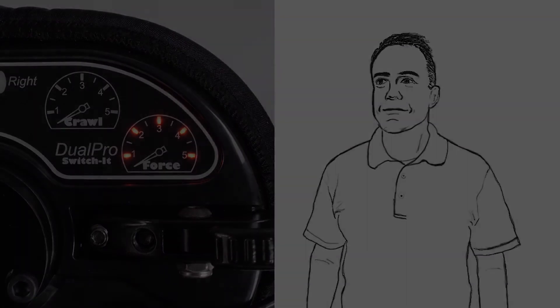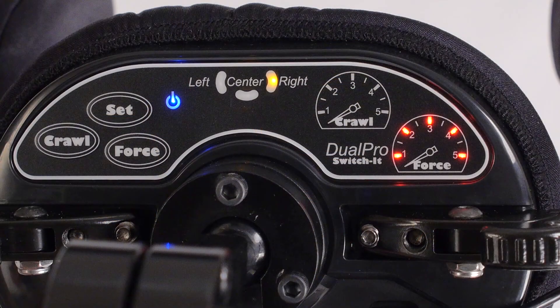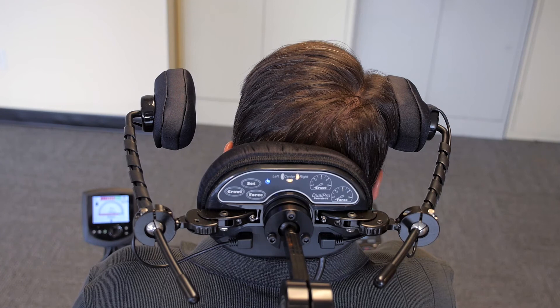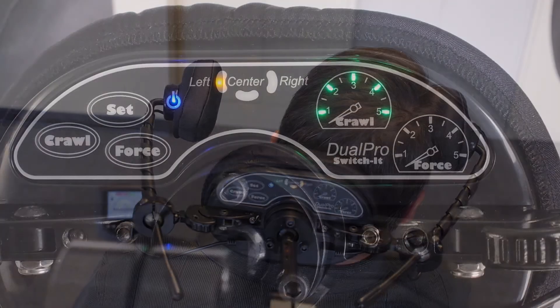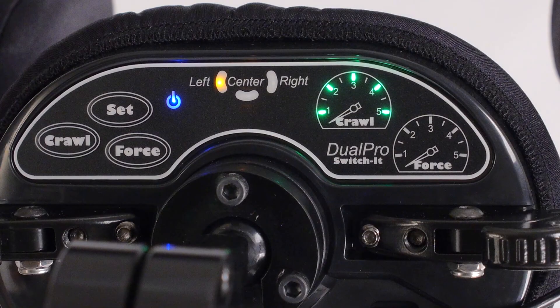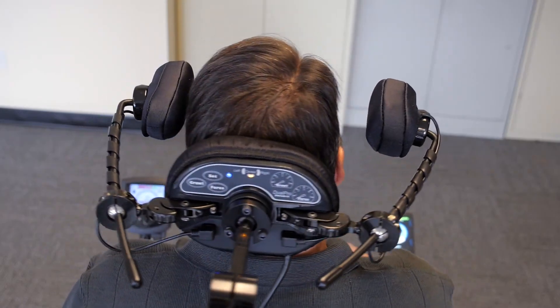A more complex example might be an individual who rests their head on the right pad and has difficulty moving it over to the left pad. In this case, the right pad could be set to five lights or maximum force with no proximity or crawl. This would allow the individual to lightly rest their head against the right pad without moving the chair. If they press harder into the pad, the chair will turn right. The left pad could be set to proximity only, so the individual would only have to tilt their head to the left to initiate a turn.